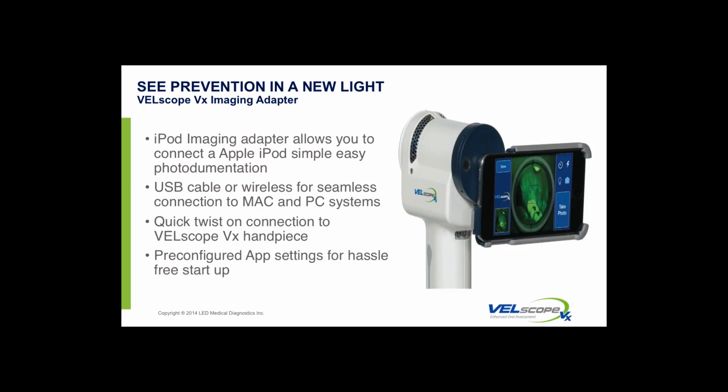But also, from one visit to the next, whether it's 2 weeks, 6 months, or a year, it gives you the ability to appropriately assess. And lastly, it has a real cool effect: patients will think it's probably the most high-tech thing you have in your practice, and I'm not lying about that.